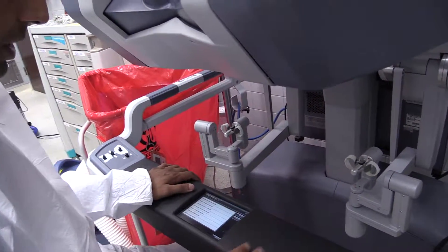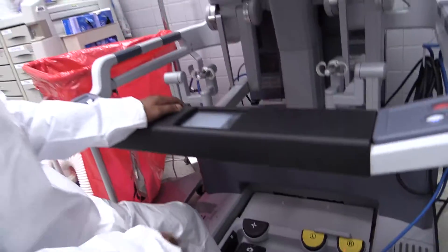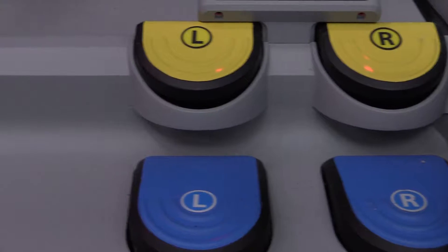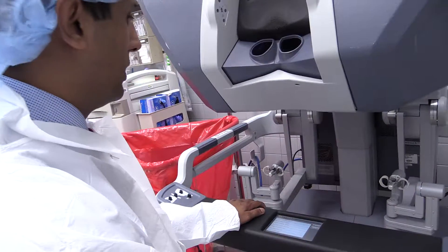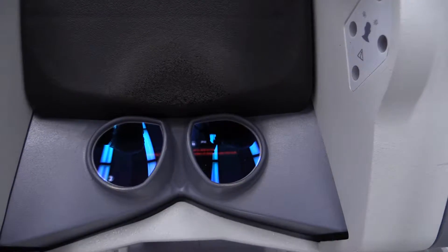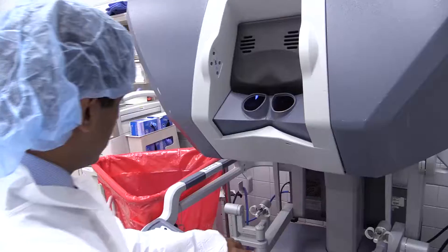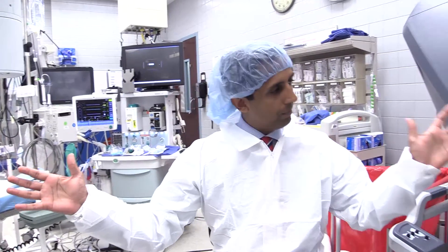The other thing you should know is that we do have pedals, so it's a bit like learning how to drive a car. You have to use your left foot and your right foot — it moves different instruments around, and you can also move your camera using your foot. So this is essentially how the machine works, and we get three-dimensional vision by looking through this viewfinder. These two pieces of machinery are how robotic surgery is performed.